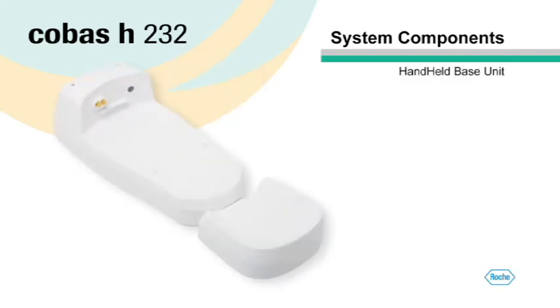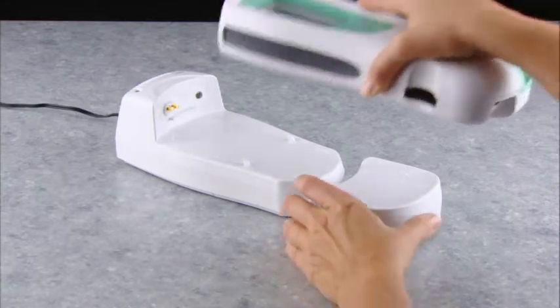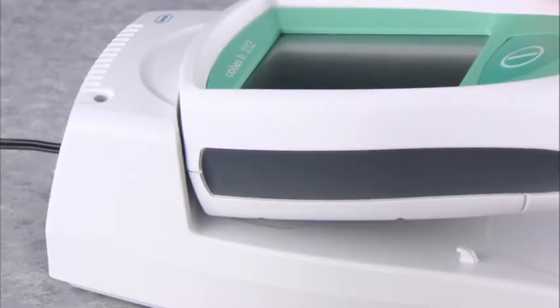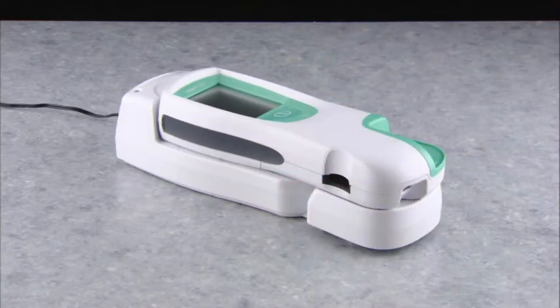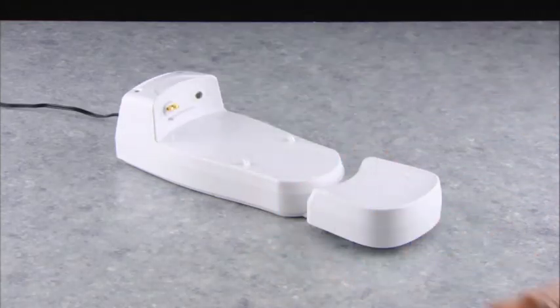The optional handheld base unit is used to connect the Cobas H232 meter to a network for data transfer. It also is a convenient place to recharge the meter. To insert the meter into the base unit, push it against the spring contacts in the upper end and lower the meter until it locks into place. To release it again, gently push the meter against the upper end and lift up from the bottom end.